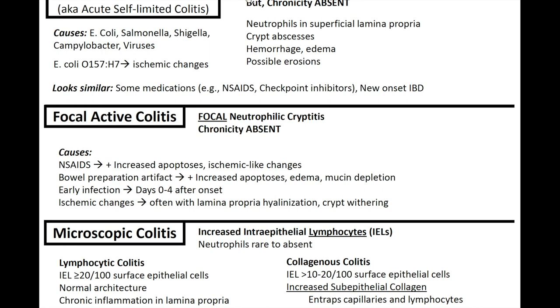In active colitis, you'll have neutrophilic cryptitis, but chronicity is absent — no architectural changes or crypt distortions. You can have neutrophils in the superficial lamina propria, crypt abscesses, hemorrhage, edema, and possible erosions. E. coli O157:H7 classically causes ischemic changes. Active colitis can look similar to changes caused by medications such as NSAIDs and checkpoint inhibitors, or new onset IBD can look a lot like active colitis.